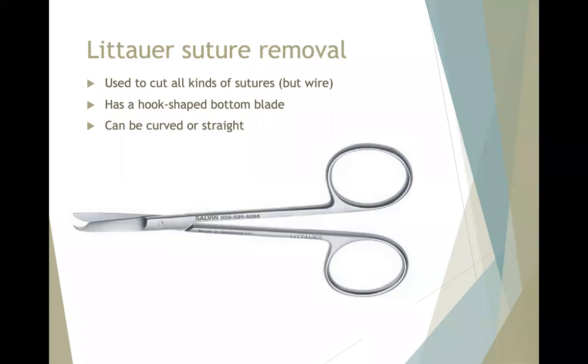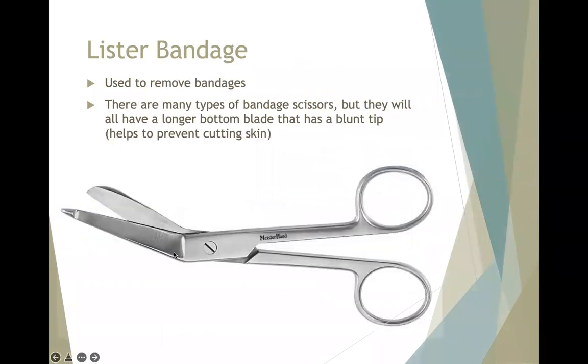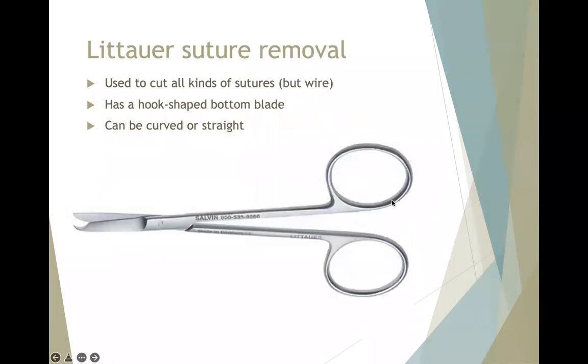Looking on sites like Amazon, they do have a lot of the surgical steel instruments like this. You could buy some suture removal scissors for around $6 to $7. Now, of course, if you want the gold plated handles and all the bells and whistles, you can get yourself to spending a lot more. But these general dirty tools, non-sterile tools, we do see a lot of assistants and technicians that just have their own. Of course, because you can keep them as sharp as you want, as clean. It's not being used by everybody, so they're going to also have a lot easier time cutting and moving them.